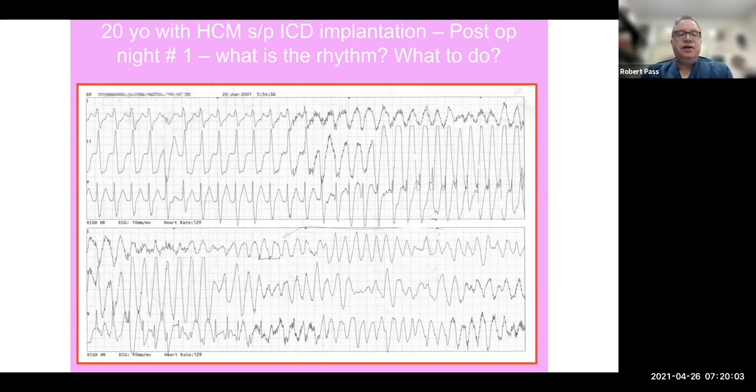And so there have been reports with this type of lead of it not being as accurate as what is sometimes referred to as a true bipolar lead, where the bipole at the electrodes at the end are spaced similar to a pacemaker lead. And so Medtronic, for example, uses a true bipolar ICD lead, whereas Boston Scientific to this day still uses an integrated lead. And you might ask, why would they do that? The answer is because what we're looking at here is quite unusual.